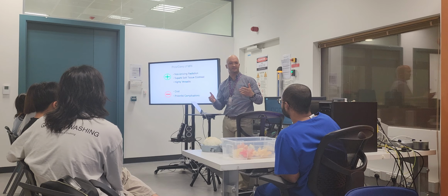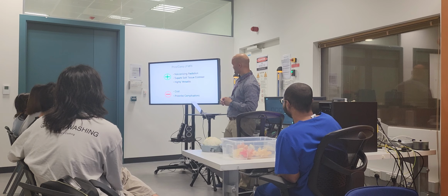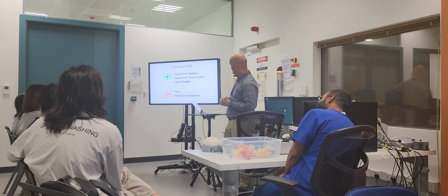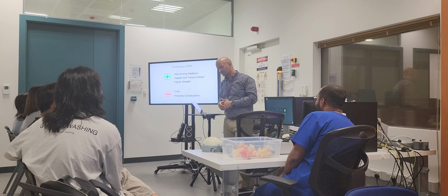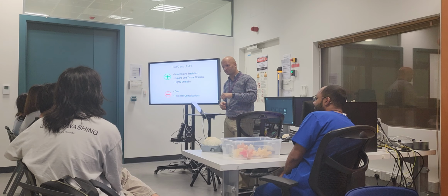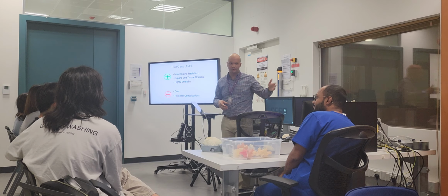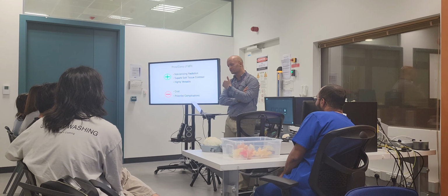Here we are sitting in a relaxed setting, enjoying a boring lecture by a troublemaker. And a potential complication: it's a very big magnet. This magnet can actually pull a truck. Junkyards have 1 Tesla magnets to pull a truck from one side to another. So if this chair gets stuck there, it will fly like a missile.